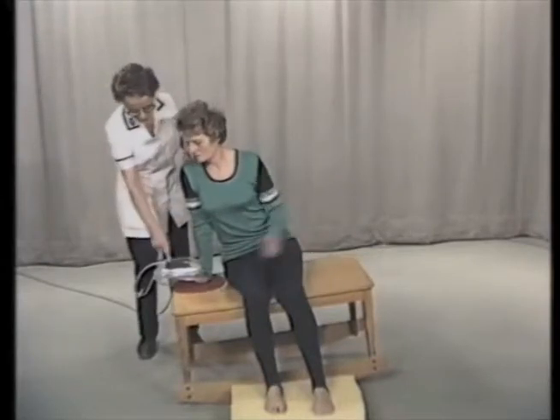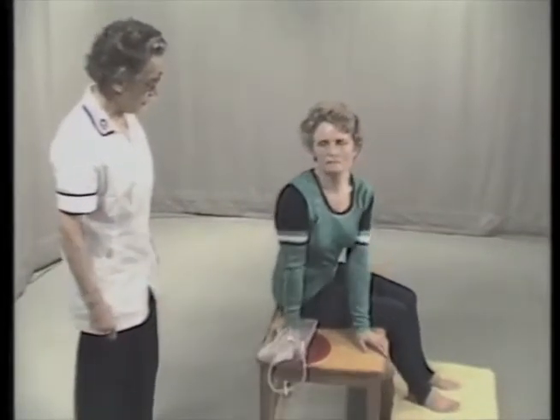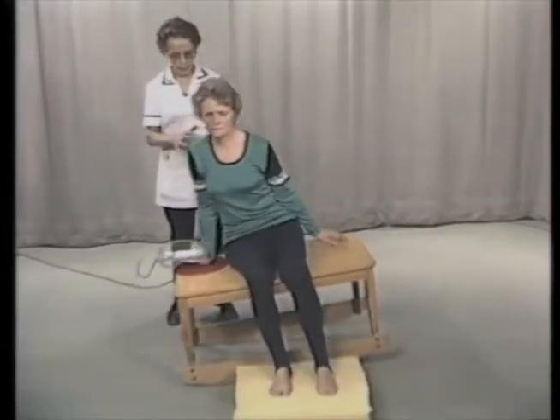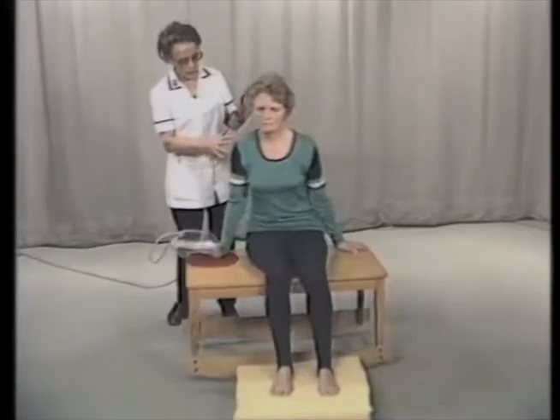Bring your hand round, look round this way, and rock. And take your hand back and rock from side to side. That wouldn't be achieved at once. We'd have to start all our stabilizings, come over here and stay.